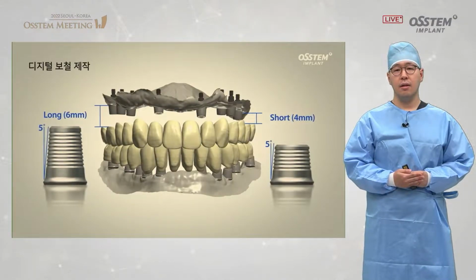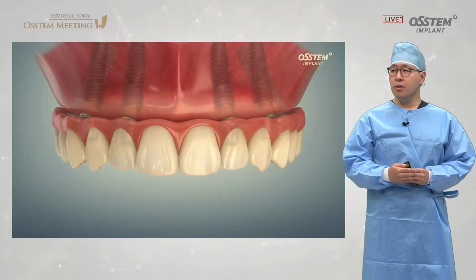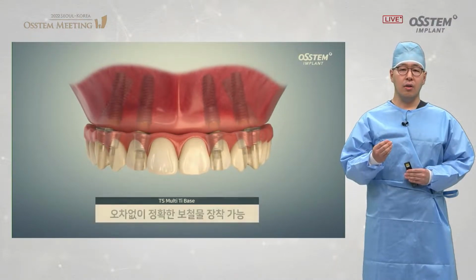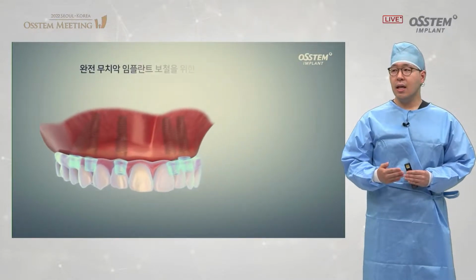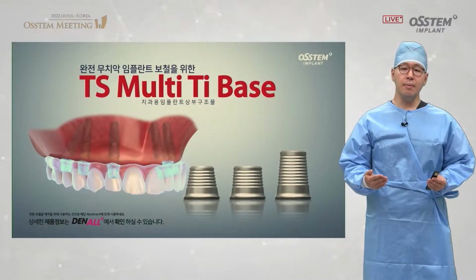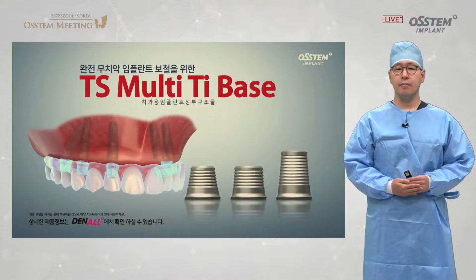So that's all thanks to this multi-tie base of Osstem. So multi-abutment will be connected, and tie base will be used as an intermediary. And I will check a prosthetic adaptation if it is appropriate. The tie base will be cemented to the pre-milled temporary.